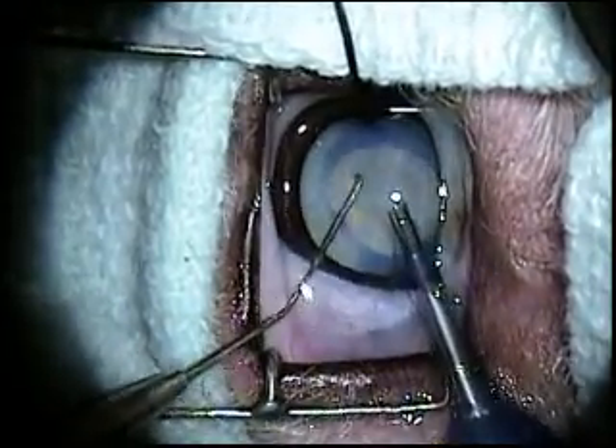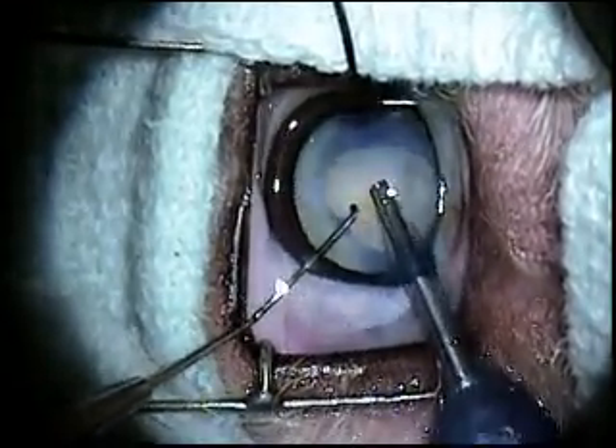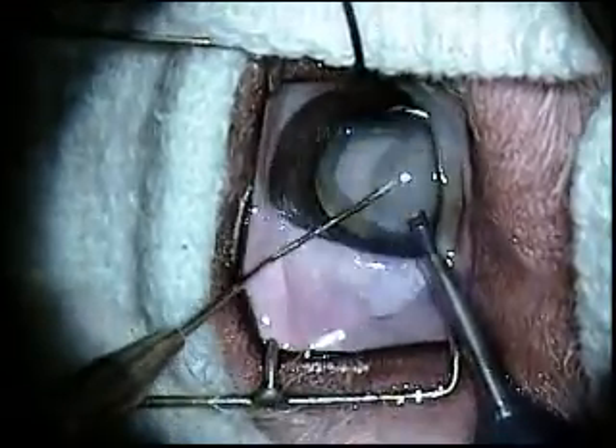As the lens clears, you will begin to see the back of the eye and the fundic reflex as well as retinal vessels.